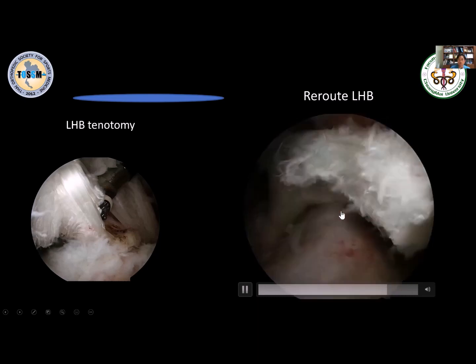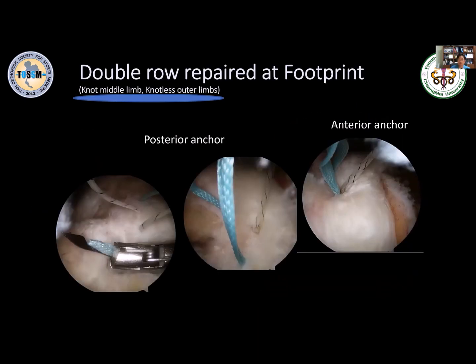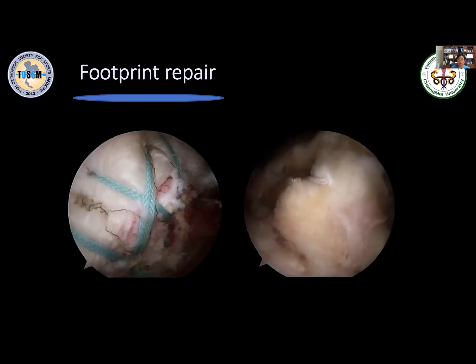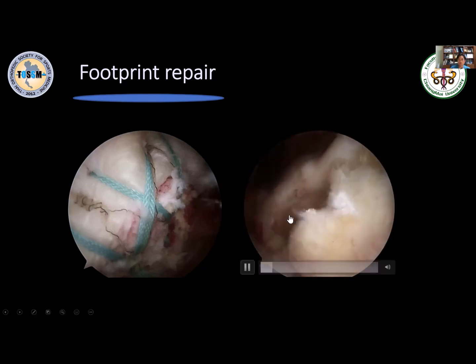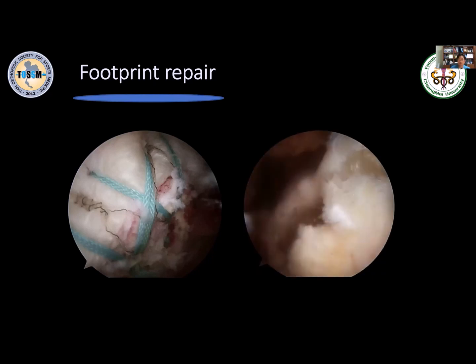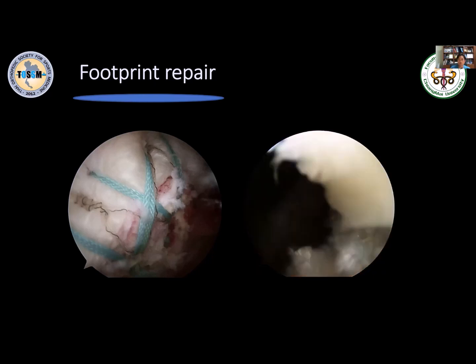So then we repair the supraspinatus like that. And this is the repair. So you're still left with a big defect like that. How will you deal with that? You can leave it like that, but I'm not sure whether the pain will be relieved or not.